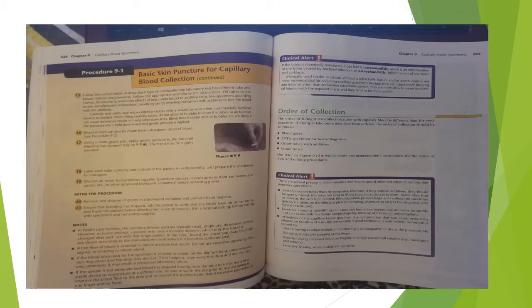If the sample is not adequate and the blood has stopped flowing from the puncture site, use a new sterile device to repuncture it at a different site. Be sure to warm the site prior to repuncturing to improve the blood flow to the area and re-cleanse the puncture site. Avoid excessive punctures on one finger and or hand. Clinical alert. If the bone is repeatedly punctured, it can lead to osteomyelitis, which is an inflammation of the bone caused by bacterial infection, or osteochondritis, inflammation of the bone and cartilage.